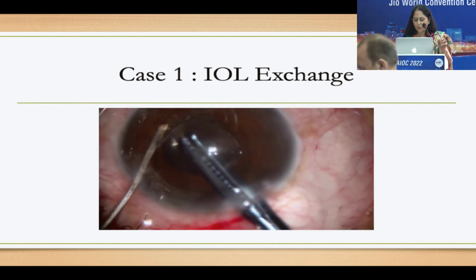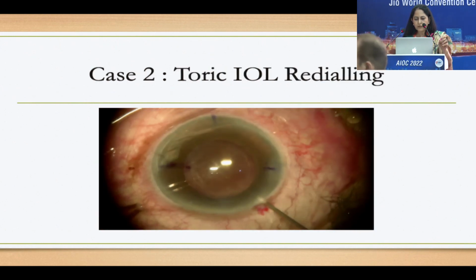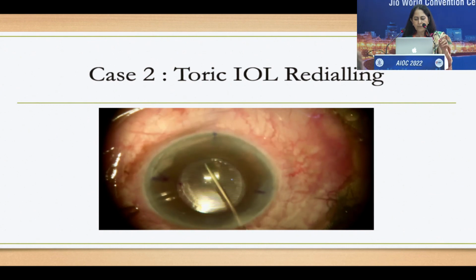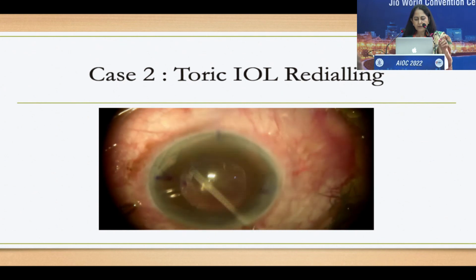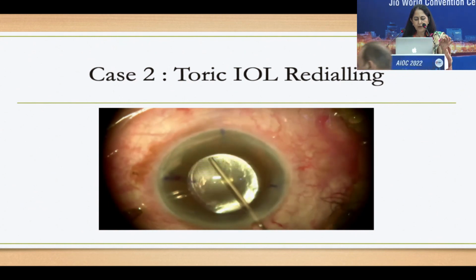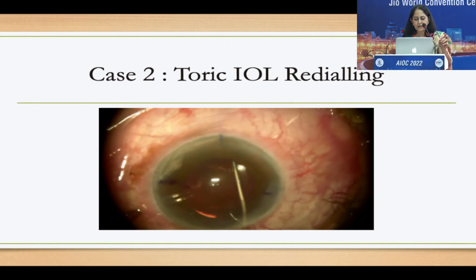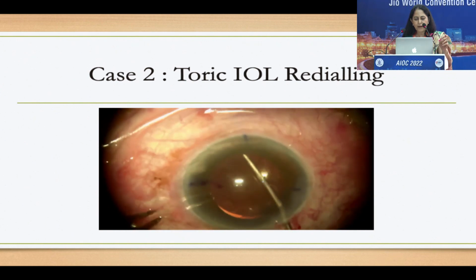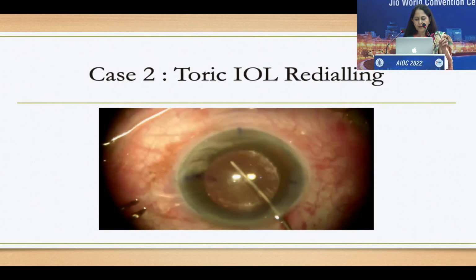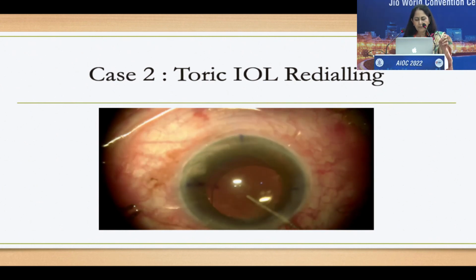And every time you do this maneuver, see that you have good viscoelastic coating your endothelium, and then you can do this very successfully. This is another case where it was a toric IOL and we had a refractive surprise. We put it through the toric calculator, and we realized that we need to rotate this lens. Again, we need to just scrape off or release all these fibrotic adhesions between the anterior capsule and the IOL, with viscoelastic which we can put slowly, gradually under the capsule. Do it all around, and once you see that the lens is mobile and moving a bit freely, then you can redial this lens into position. But all these maneuvers have to be done gently, and the earlier you realize that there is a refractive surprise and you deal with this, the easier the surgery is. And the only thing is you need to counsel your patient well.